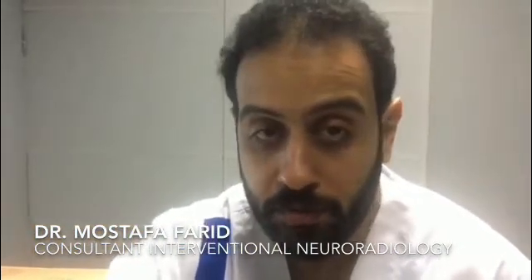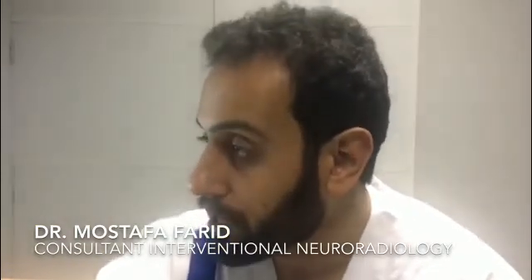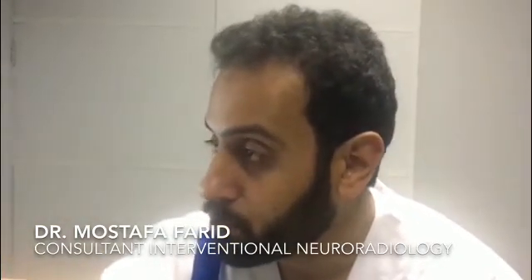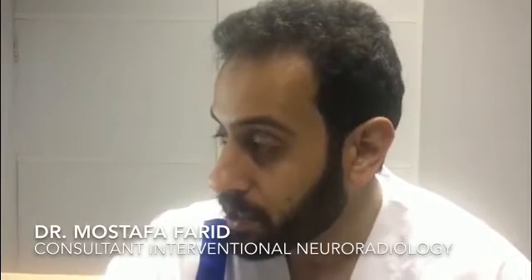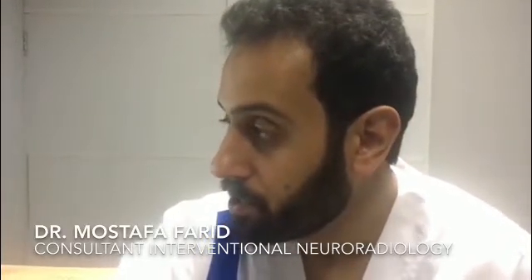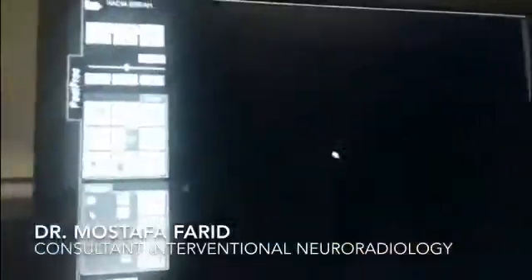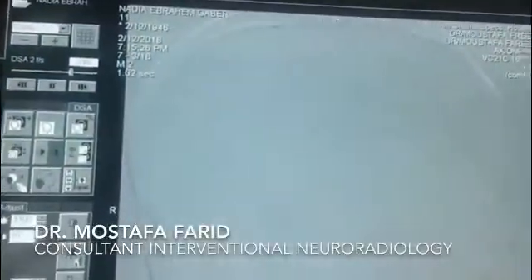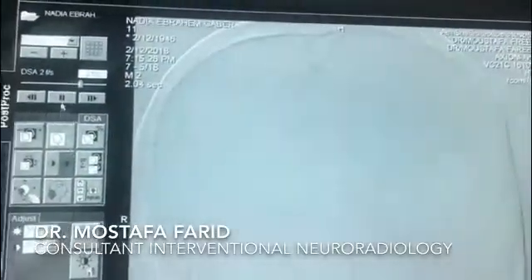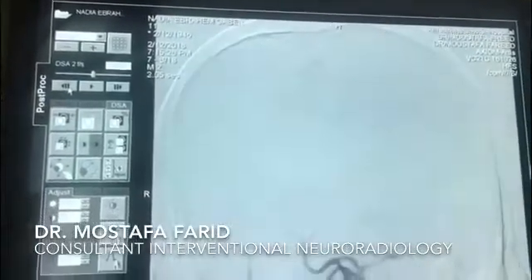There is a risk of injuring the internal carotid artery during surgery, so he asked me today to perform a balloon occlusion test. As we can see here in plane A, these are the arteries supplying the brain on the right side.